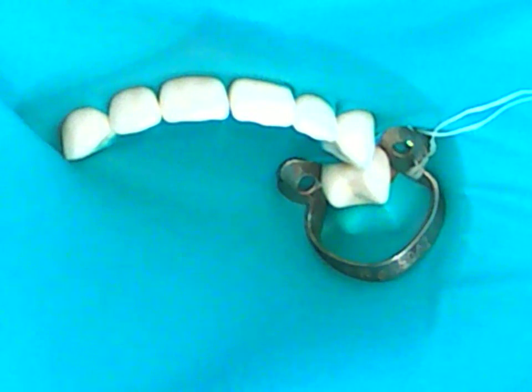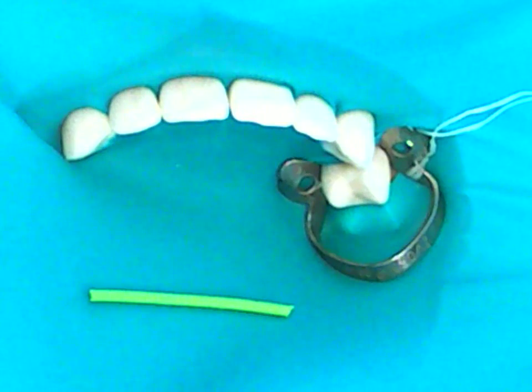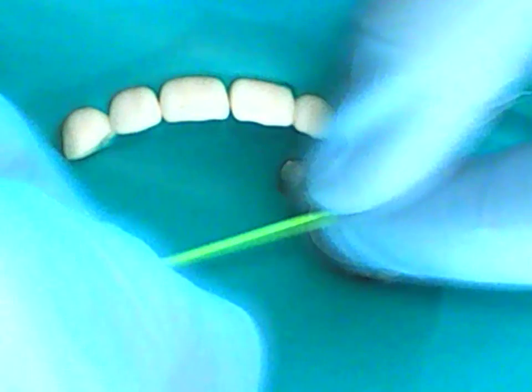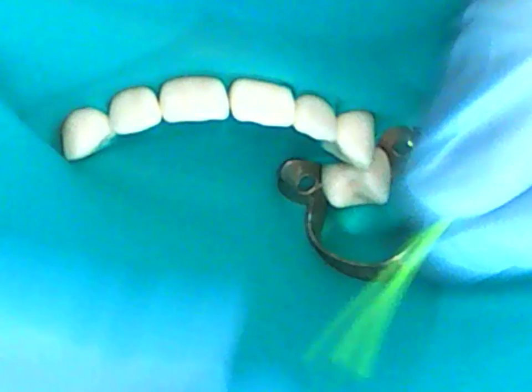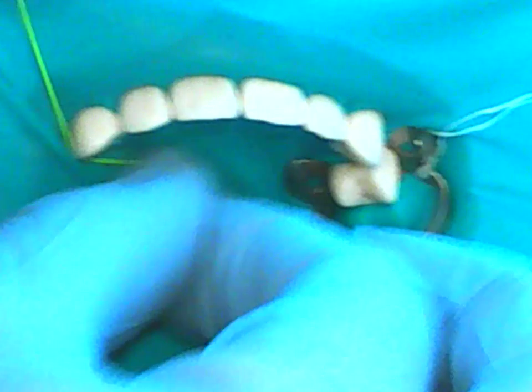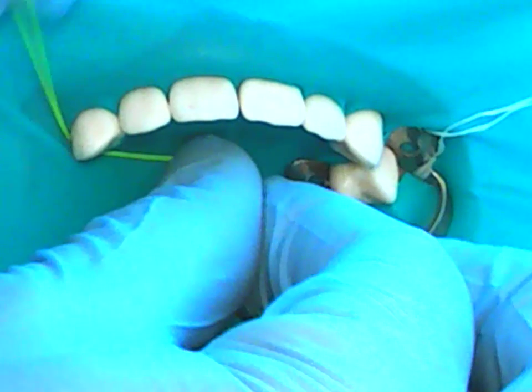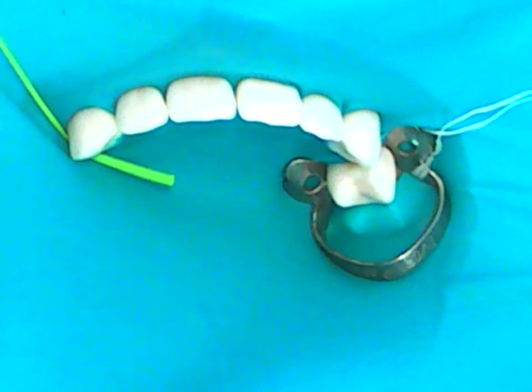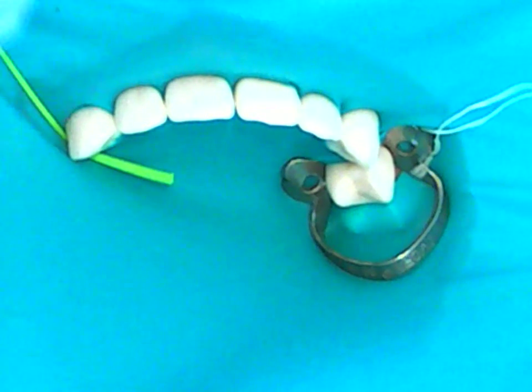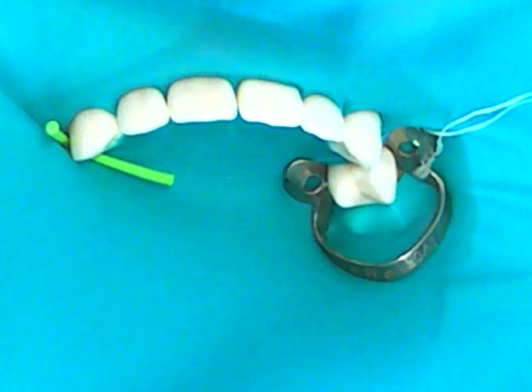Okay. The last type of ligature that I love using is a stabilizing cord. So that's what a stabilizing cord is. It's very stretchy, very similar to a piece of floss, elasticized floss, basically. And you would insert it the same way as a piece of floss. You go back and forth until you're through that contact, similar to how you'd use the corner of the dental dam. Again, a little bit of excess there that we probably don't want. Once this is placed, you don't want to drag it towards the facial to get it out of the lingual. Not a good idea. That will injure your client.